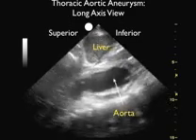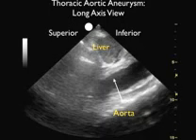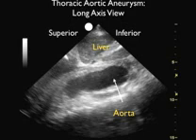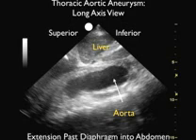And notice that this aneurysm is going to originate in the thoracic cavity, and we can see here that it moves past the diaphragm distally to involve the abdominal aorta. So this is not a simple abdominal aortic aneurysm or AAA. This is a thoracic aortic aneurysm that descends past the diaphragm into the abdominal aorta.